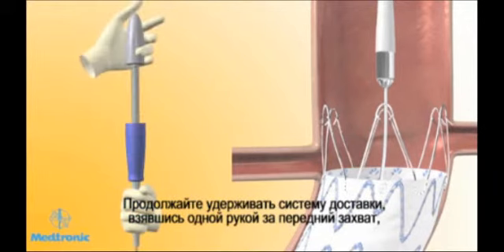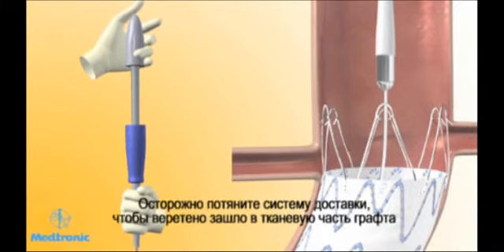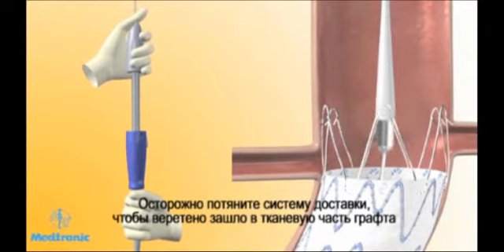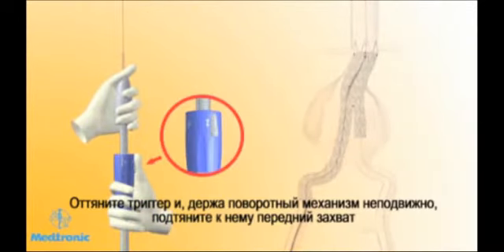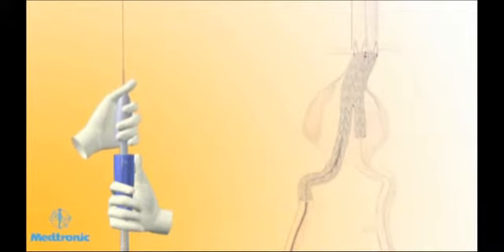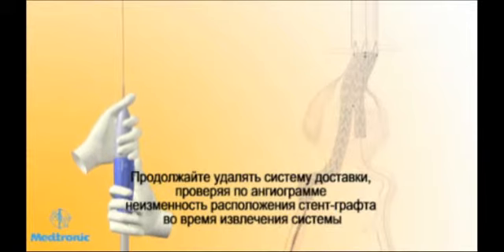To configure for removal, continue to hold the delivery system with one hand on the front grip and the other below the slider. Gently torque and withdraw the delivery system until the spindle is retracted into the fabric portion of the stent graft. Pull back the slider trigger and hold the slider stationary while bringing the front grip to the slider. Gently remove the delivery system using fluoroscopy to ensure that the stent graft does not move during withdrawal.